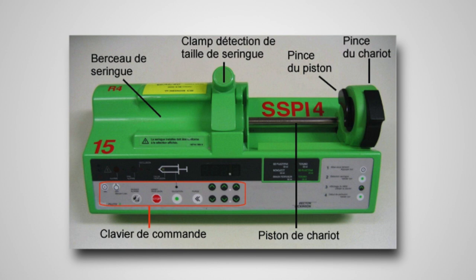Un pousse-seringue électrique fonctionne avec l'alimentation en secteur et sur batterie grâce à une batterie interne. Nous recommandons de laisser charger la batterie interne du pousse-seringue électrique avant de réaliser cette maintenance préventive, et nous recommandons d'effectuer la maintenance tous les 6 mois.